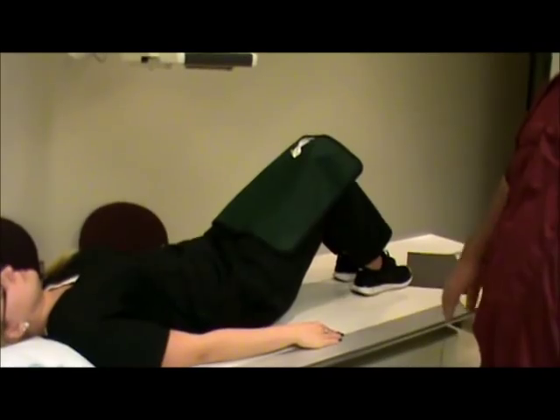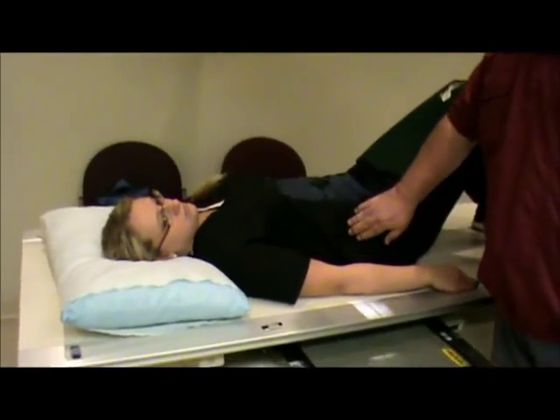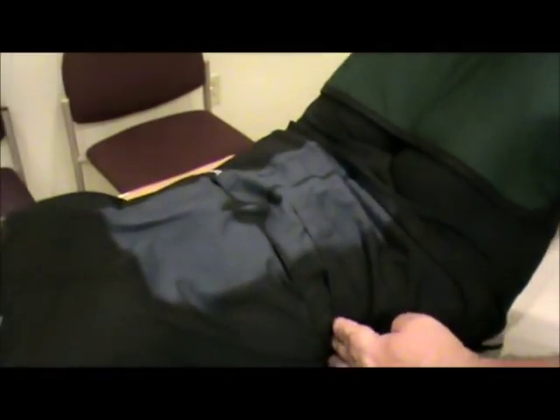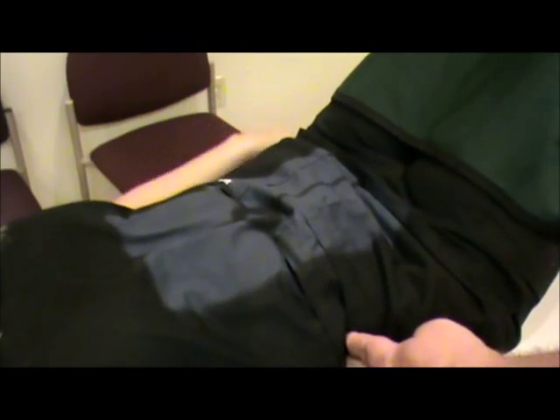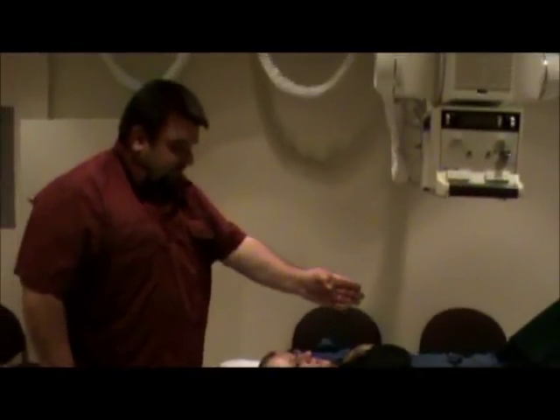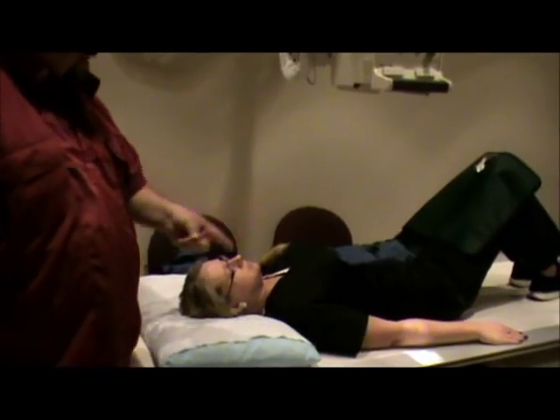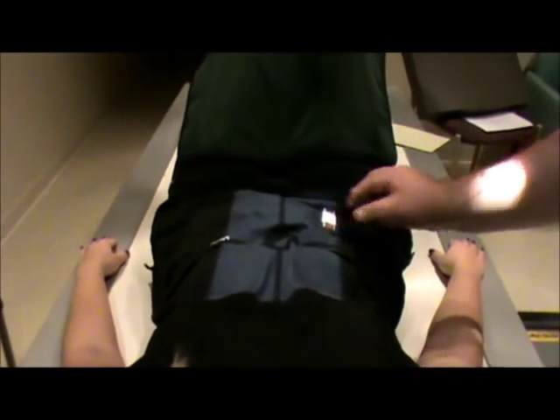The patient is supine. We're going to center by palpating the crest — we're going to go about one and a half inches above the crest. The centering will be to the MSP. I like to go to the top of the table and look down the patient, just verifying that I am in the center. The collimation will be to the IR borders up and down, and side to side will be about four to five inches wide. We have clean room here for our marker placement in one of the corners of the film.